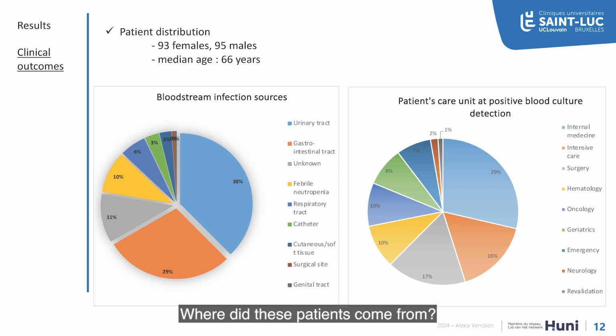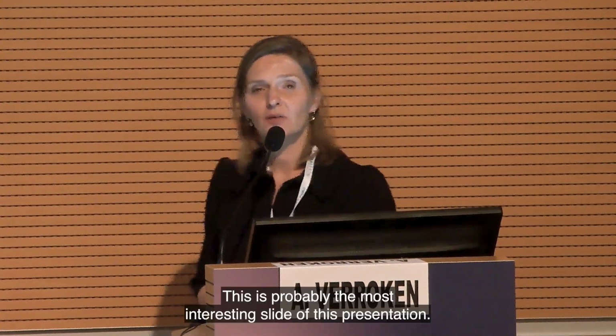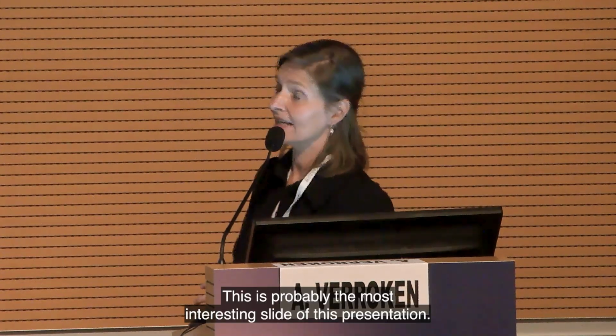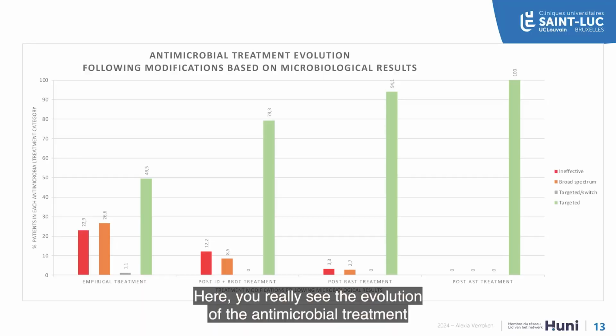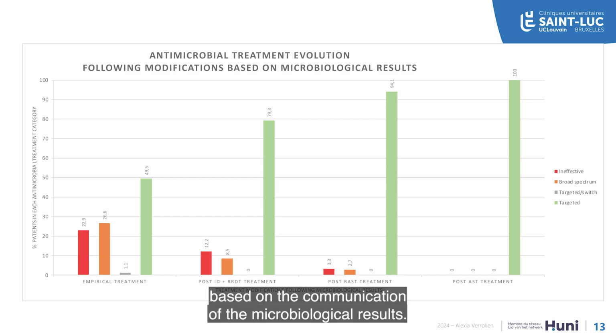Where did these patients come from? Most of them from internal medicine, followed by 17% from surgery, followed by intensive care, 16% of the patients. And this is probably the most interesting slide of this presentation. Here you really see the evolution of the antimicrobial treatment following the modifications based on the communication of the microbiological results.